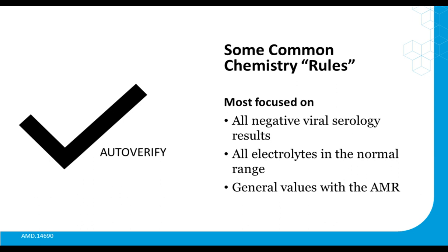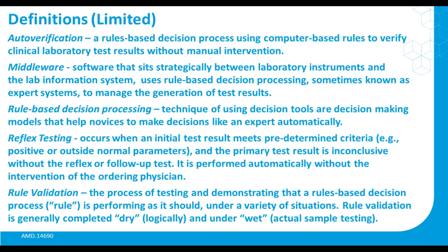Some folks in the audience are probably nodding their head, they're already doing this, but it's my understanding that the vast majority of people had not even begun to apply auto verification because they've never been exposed to it. We can learn a lot from the world of chemistry. So I want to turn your attention to some limited definitions that I've put on screen, and it's my understanding that my presentation, along with these definitions, will be available after for you to reference, so I won't read through them all, but here's some common definitions that may be somewhat foreign to some of you, but it really comes down to the idea of applying program logic, right?